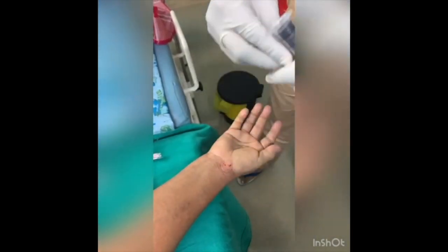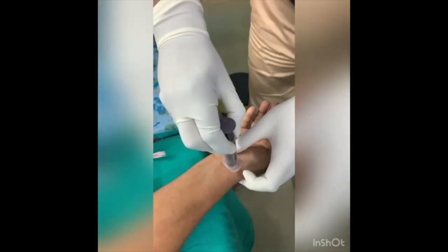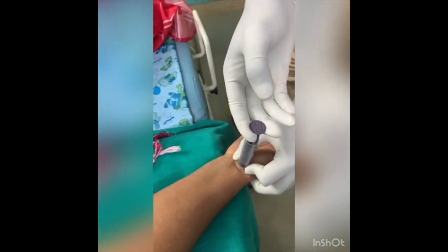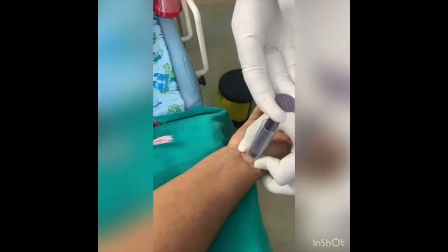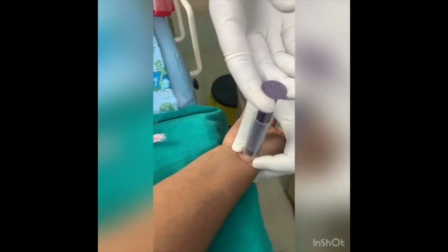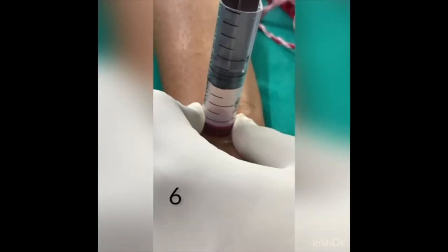We are applying the suction to that particular area and wait for 10 minutes. Continuously doing this procedure may cause lateral epicondylitis to the doctor. This procedure is a bit strenuous but it is very effective.